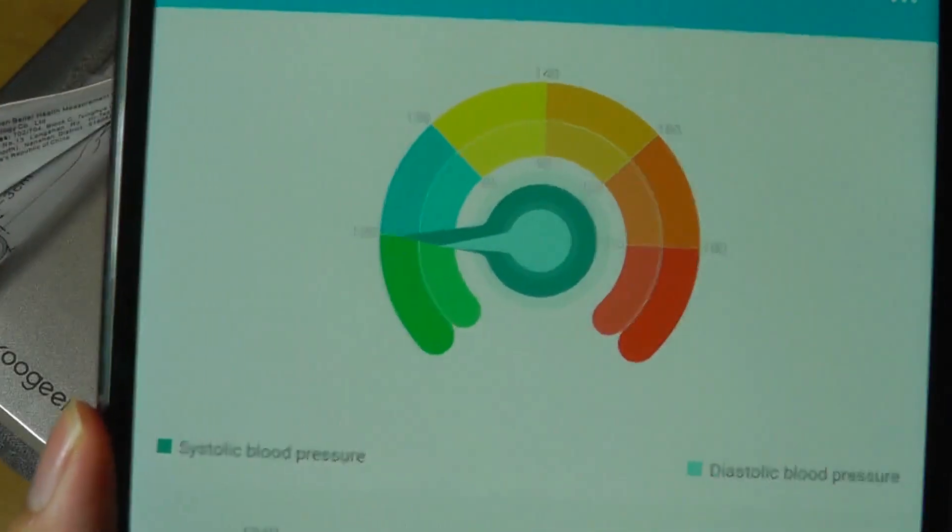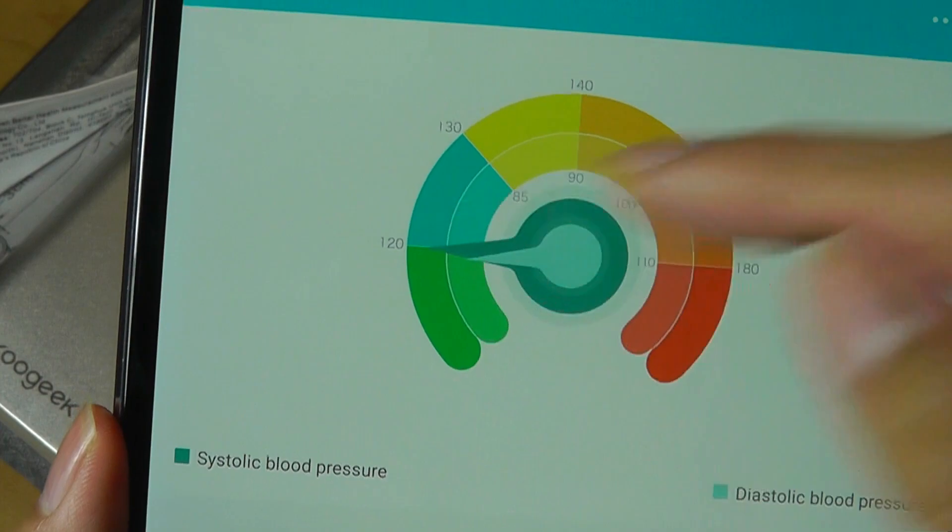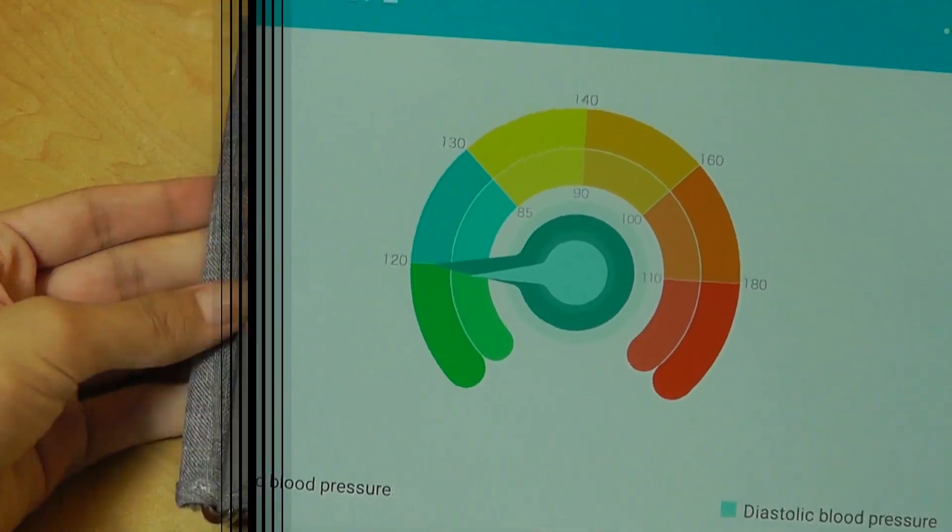After a measurement, it tells you your status — whether it's healthy or not. If you're in the green region you're good, and if it's in the red region it's considered a critical condition.